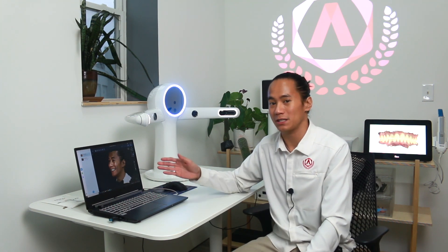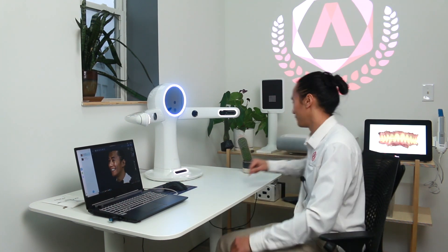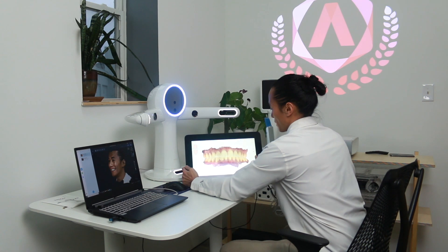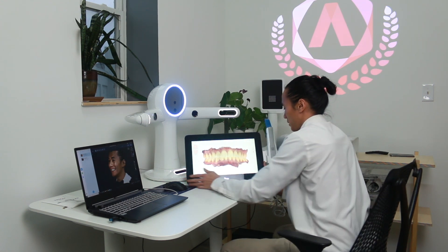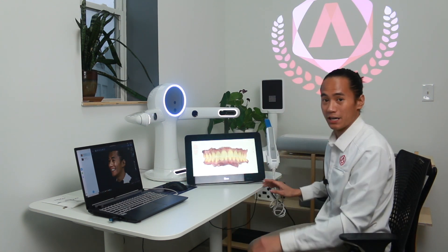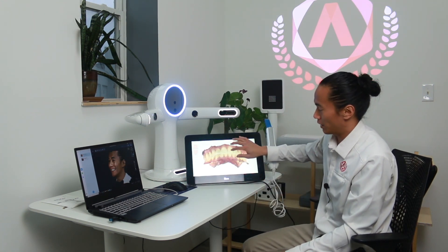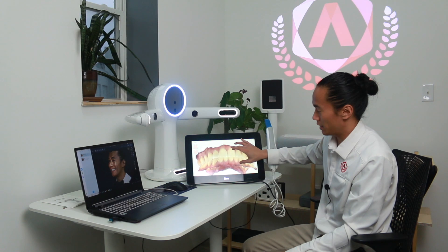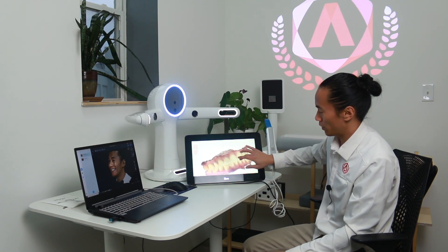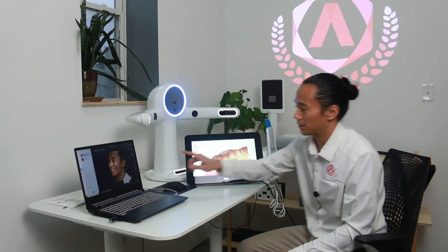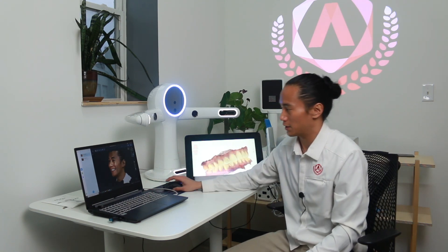Once the software has successfully 3D built our face scan, what we're going to do next is align the 3D face scan with intraoral scans. I've already taken my intraoral scans here using our iTero, and now we're going to align these 3D intraoral scans here in the software.